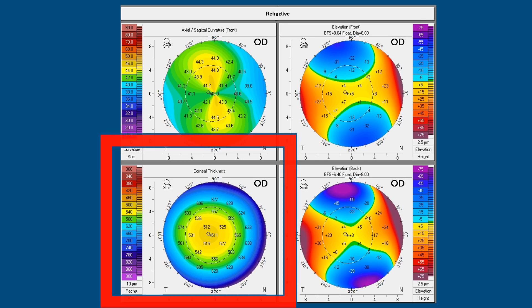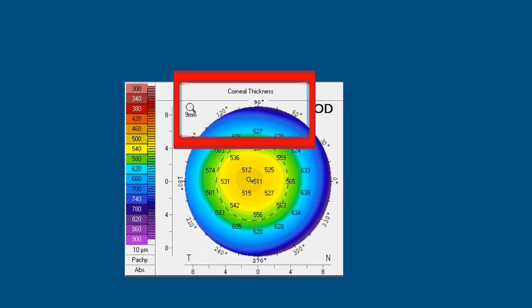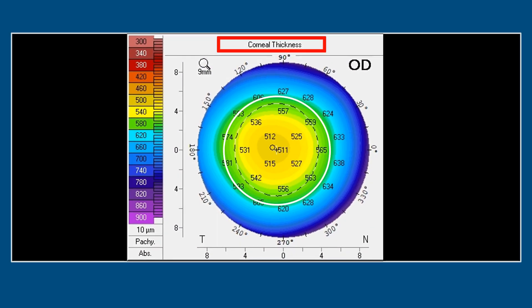Finally, in the pachymetry map there is a 5 mm circle, important as it was in the sagittal map. You compare the superior and inferior thicknesses at the 5 mm circle — for example, the thickness superiorly is 627 microns while inferiorly it is 620 microns. You compare these two for the interpretation of the topography map, along with the thinnest location and the pupil center.